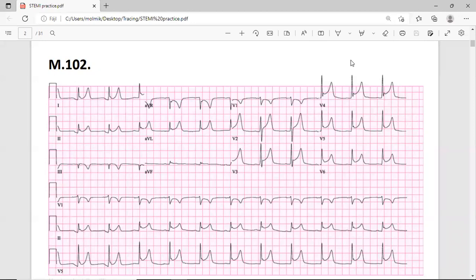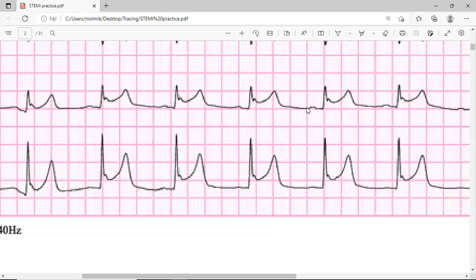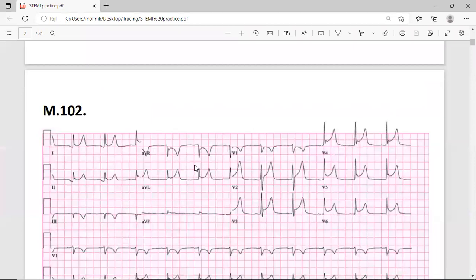Okay, now tell me. Just a disclaimer, I struggle a lot with the ECG and I'm not sure if I am on the right track, but I will try anyway. So starting with the rhythm, it seemed pretty regular to me. Okay, good. And then the rate was around 75 because you have 4.5. That's okay. And then you went to the impulse formation, the P wave. It was there, but barely perceptible. You can see some P waves, but not as big as we used to see. But we still have positivity in lead number 2 and negativity in aVR. So you can say that, yes, that's a sinus rhythm.